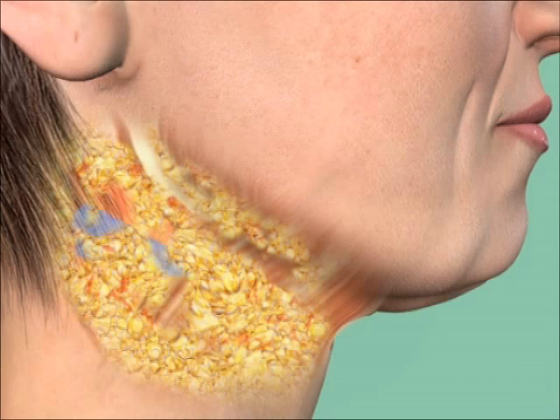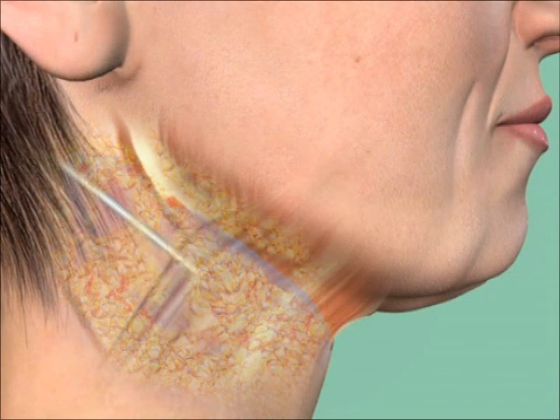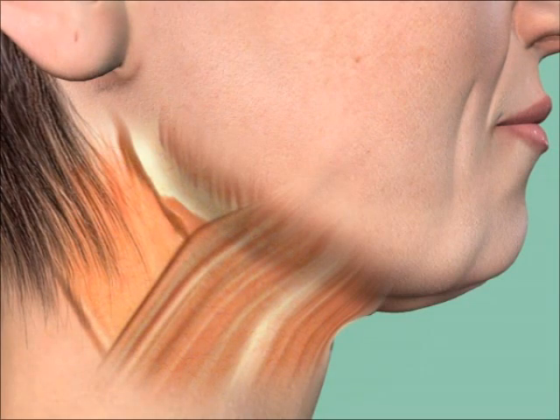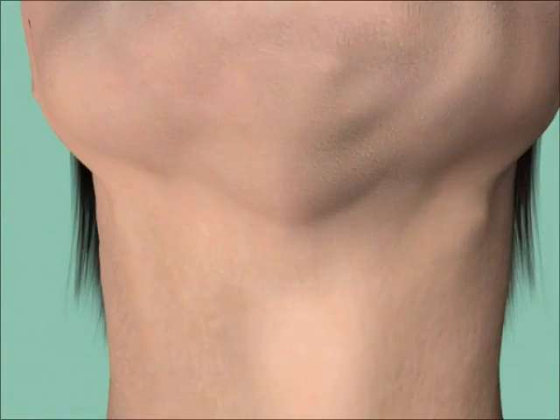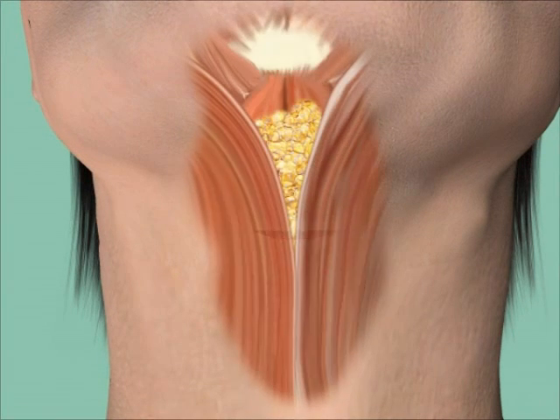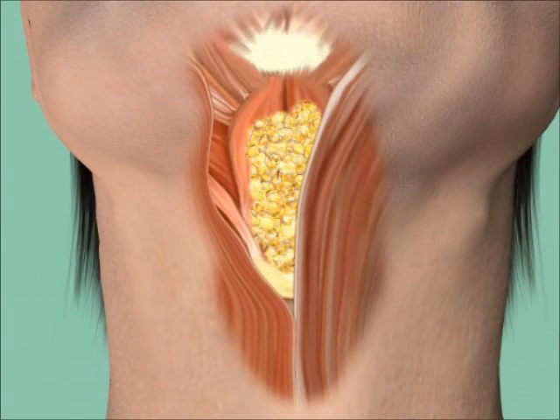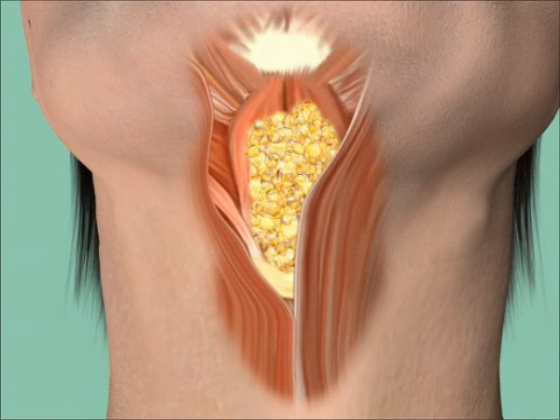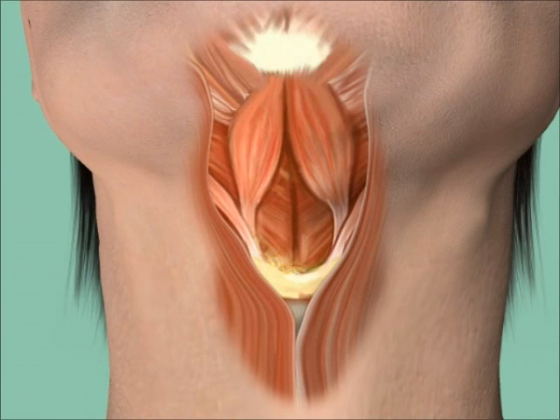The cervical part begins with an extensive infiltration of the subcutaneous fat, and we proceed to liposuction. A submental incision is located 1 cm posterior to the submental fold. We remove the subplatysmal fat and cut the cervical platysmal cords.